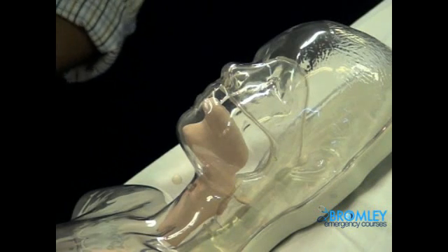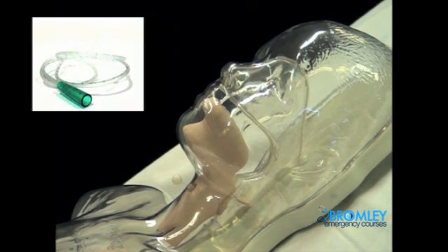This is a demonstration of NG tube insertion. Ideally we want the NG tube to be kept in the fridge or freezer for a while so that it is quite stiff, so that it can pass easily.